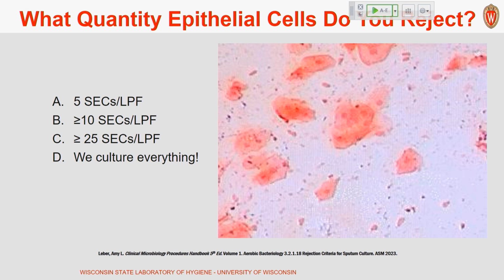Yeah, I think that's a good point. To go along with that, as I showed in the slide earlier, the diagnostic yield of a lower respiratory tract culture is fairly variable, but definitely not exceeding 40%, and that's on specimens that are acceptable for culture. So if you're trying to widen that net by accepting specimens that have a high epi count, even though they have associated PMNs, you're probably further reducing the sensitivity of that lower respiratory tract culture.